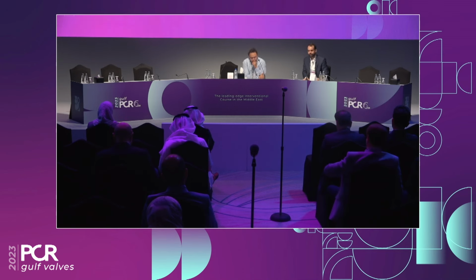I don't know, Fadi, if for this commissural alignment with this valve, it's an easy coronaries. Maybe you're going to do the commissural alignment to prevent degeneration, HALT, MALD. But I don't know if the concept of HALT will develop in Navitor compared to Accurate, because the data is still emerging and not consistent. But now we have the belief that let's do commissural alignment.